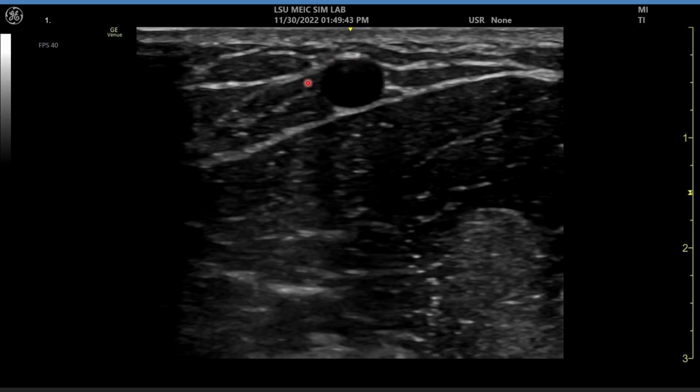Again, people that lift heavy stuff for fun, is the way I was taught, may have more prominent cephalic veins. People with issues of blood flow going back into their central circulation, these may pop out more. But a lot of folks, it may only be as big as my laser pointer. That'll be very difficult to access or get a catheter floated through. But let me just color this out on the next slide, and then we can move on to our next steps in the lecture.